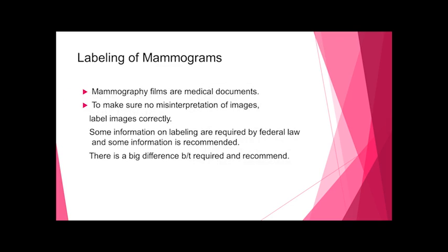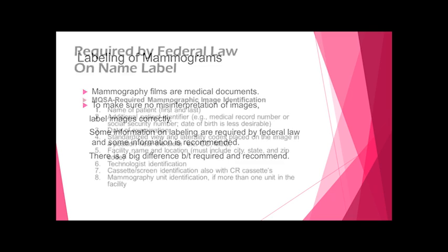All right, let's go on and talk about labeling of mammograms. Mammography films or images are medical documents. To make sure there's no misinterpretation of images, there must be a correct label on it. Some information on labeling is required by law, and some information is just recommended. So you have required and recommended. There's a big difference between the two.